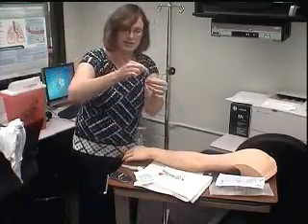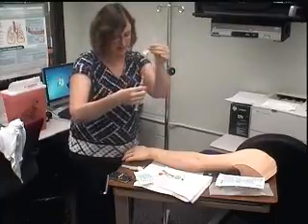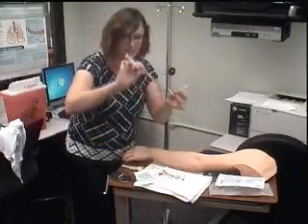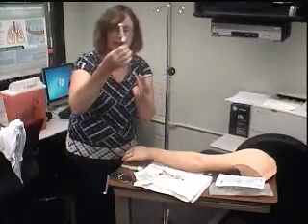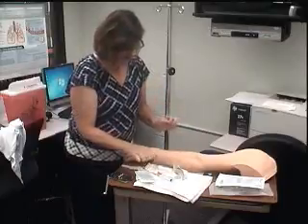So I prime it until I see little drips of saline come out. Then I keep the lid on so it stays clean and sterile, and just set it on the table. I'm going to keep this saline lock attached. All right, now I'm going to prepare everything that I need.